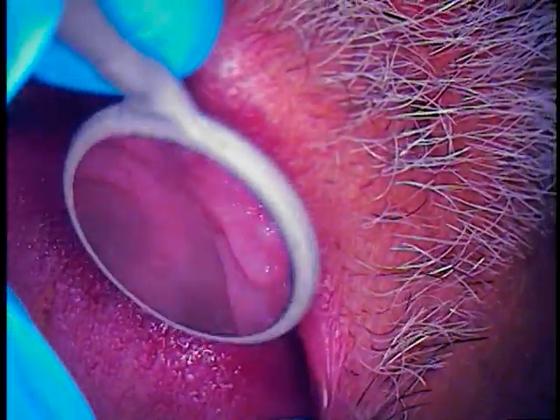Hello and welcome. This is Dr. Jerry Cuomo. I'm here with another rescue case. This is a Strauman case referred to me by a local dentist.